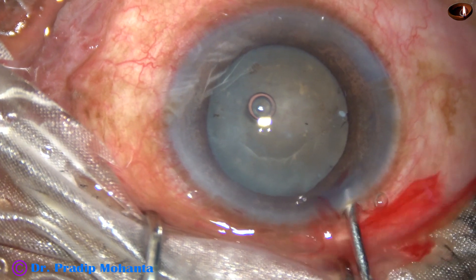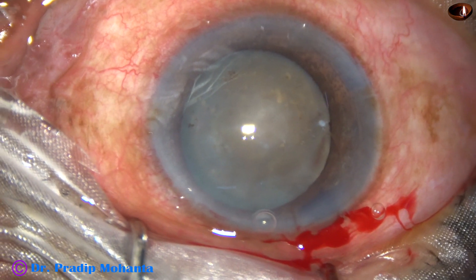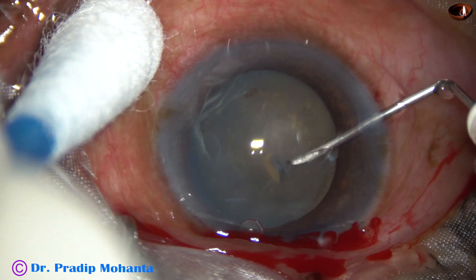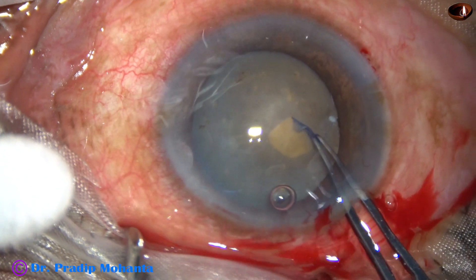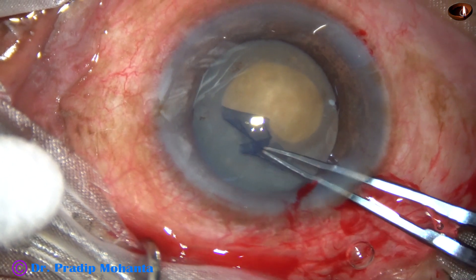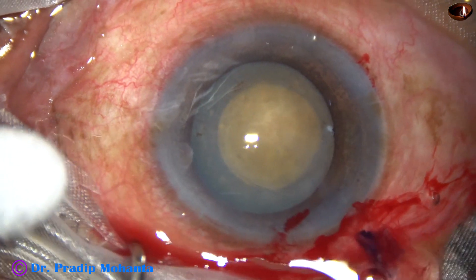2% hydroxypropyl methylcellulose is injected into the anterior chamber. Now is the time to do capsulorhexis. I take a 26-gauge bent needle and see what happens as I try to incise the anterior capsule head. You can see the whole lens moves and there is wrinkling of the anterior capsule, meaning there is zonular weakness. So I have planned to do a small rhexis so that if CTR is required, I can easily put the CTR in the capsular bag. If the rhexis is large or if it extends, placement of CTR becomes very, very difficult.